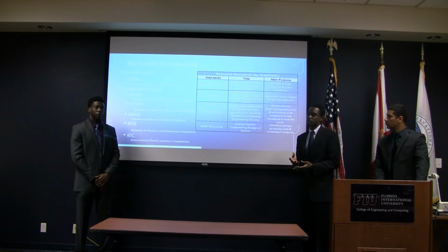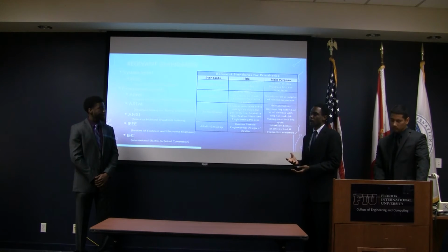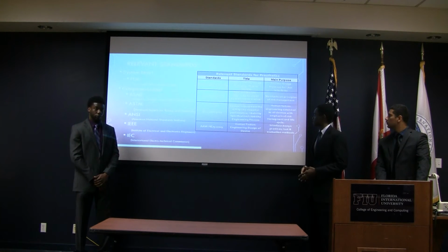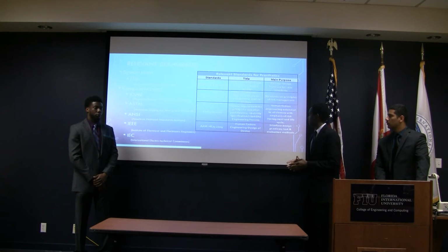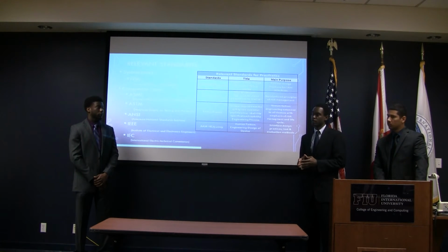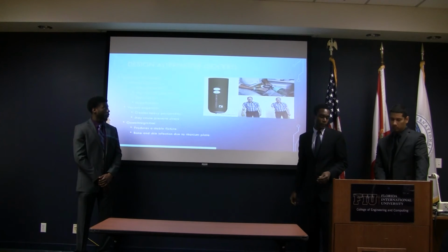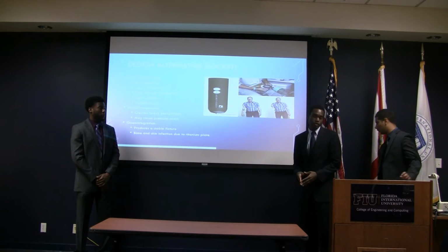How much is a prosthetic actually functional, and how does it assist a person throughout their everyday lives? Our main purpose is pretty much human factors engineering extended to all devices with emphasis on risk management and life cycle. We have to make sure the device is functional and does not cause any harm, and enables a person to implement the task as it's supposed to. Now, Chris will delve into our alternatives.